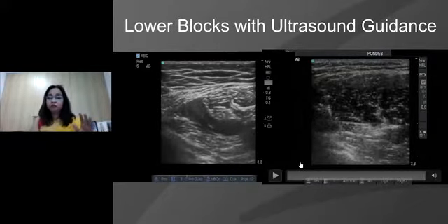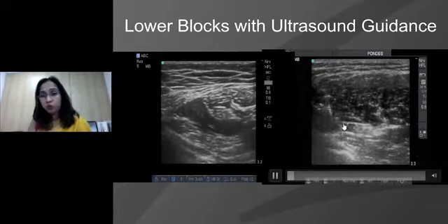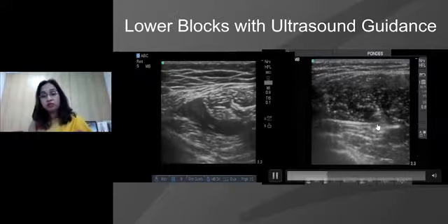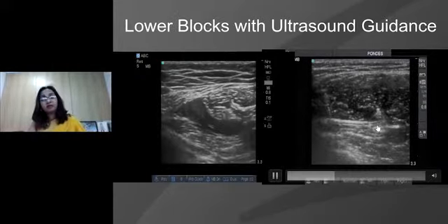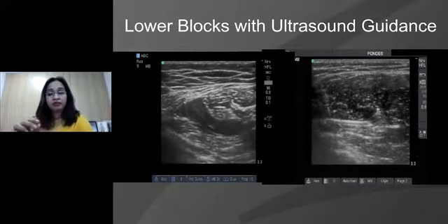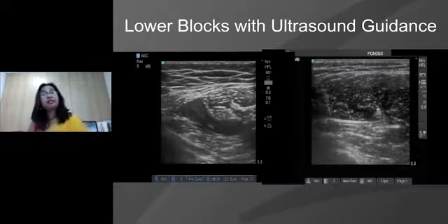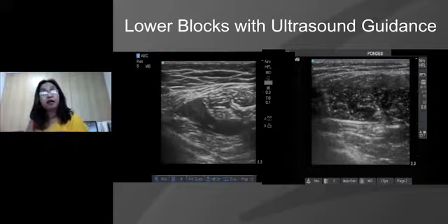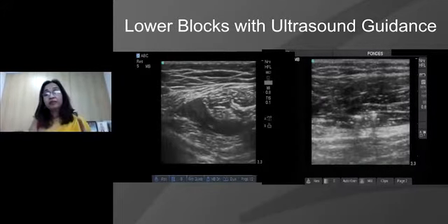A simple Tuohy needle can be worked upon here. So the Tuohy needle walks in right here. You can even see the lumen. I can see the sciatic nerve right anterior, and we can see the catheter jetting out of it. And we can fix the catheter at this particular distance, and you can give a continuous sciatic perineural catheter block for a child, say, for example, for an ankle fracture or for CTEV repair, that is congenital talipes equinovarus repair. But don't forget to tunnel the catheter, and also remember the catheters are going to leak.